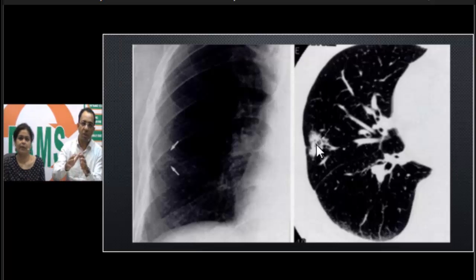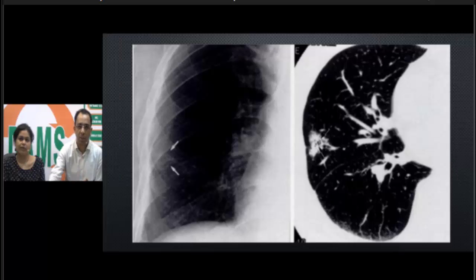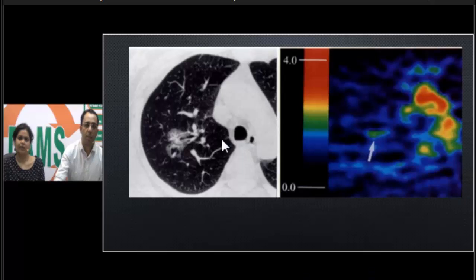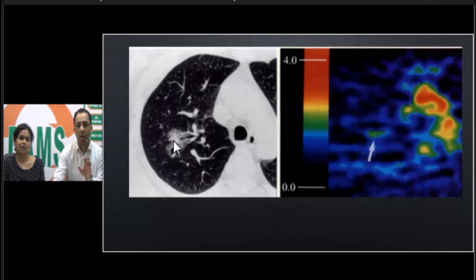Sometimes surrounding the lesion there is a halo of ground-glass appearance, which can be seen in these lesions. Looking at another patient, you can see a bronchoalveolar lesion which again appears as a consolidative lesion — an airspace lesion with a patent bronchus.